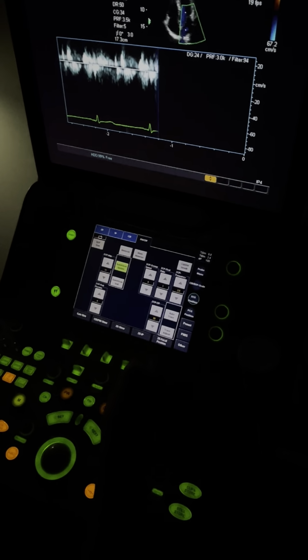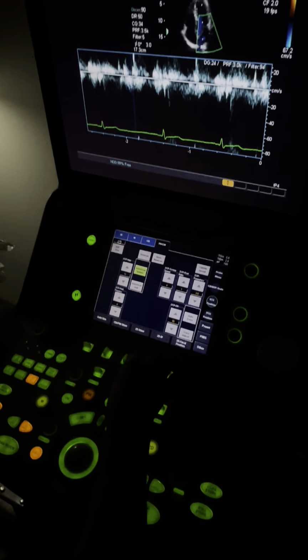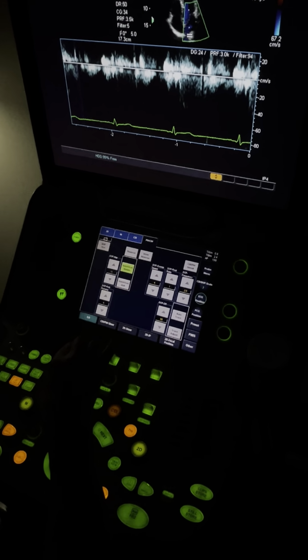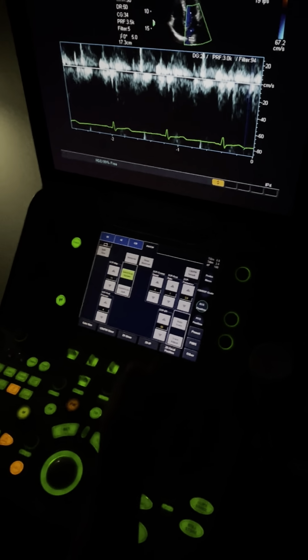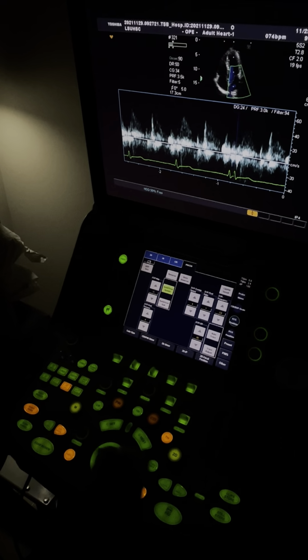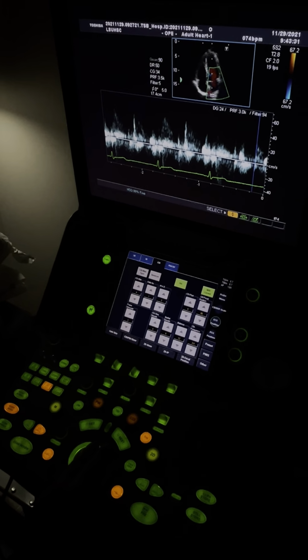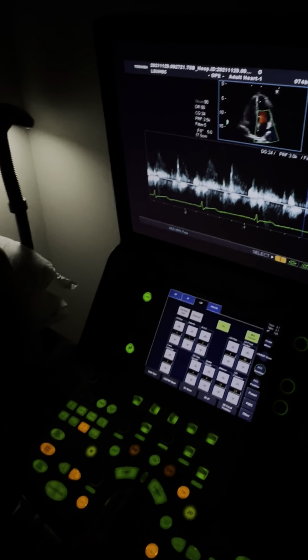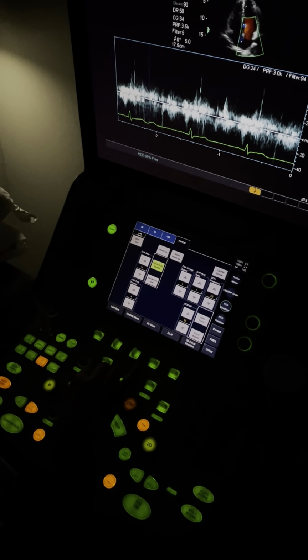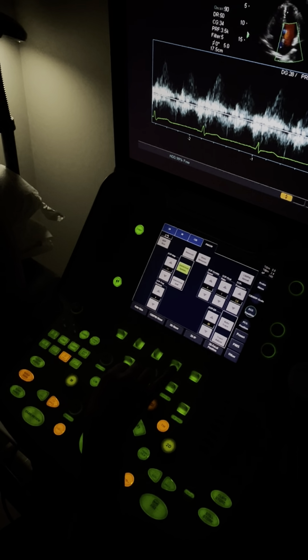Is everything 3 to 5? Well, yes. But he would want you to be probably at 5 for here, and then mitral inflow would be 3. Is that a pulmonary vein? Pulmonary veins, so I'm... Oh, the S and the D. There they are.